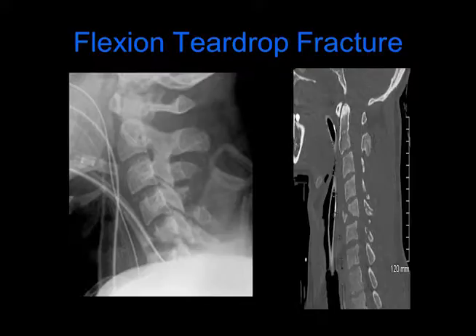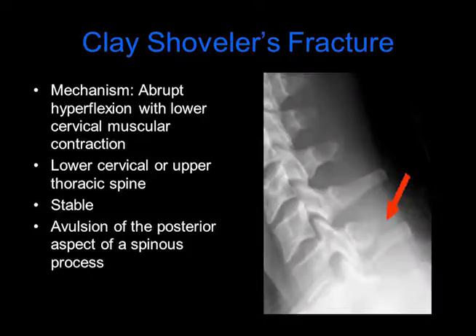On the right is the corresponding CT scan image. A clay shoveler's fracture is a fracture of the posterior aspect of a spinous process, most commonly the C7 or T1 spinous process. The mechanism is abrupt hyperflexion with lower cervical muscular contraction. This is considered a stable injury.